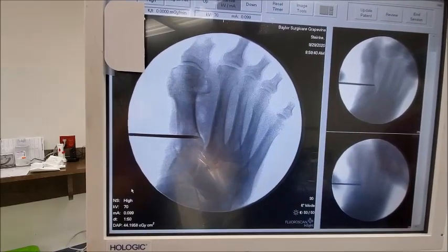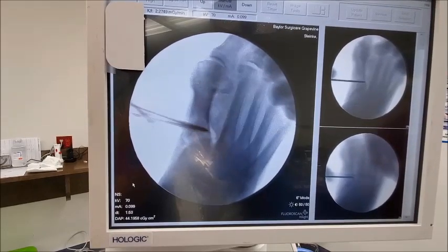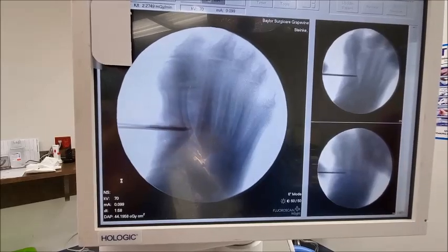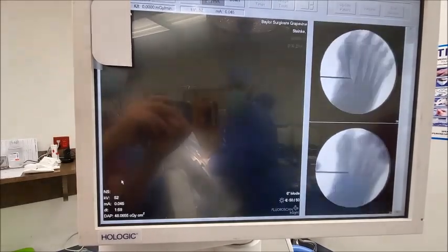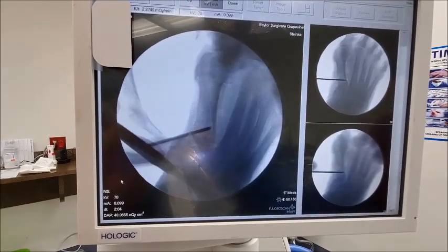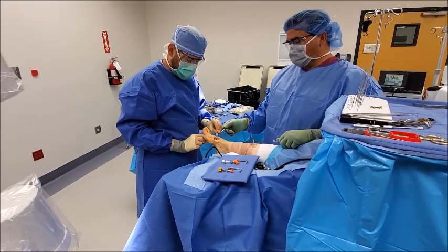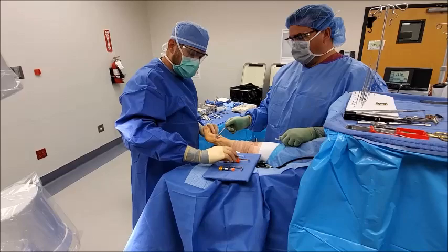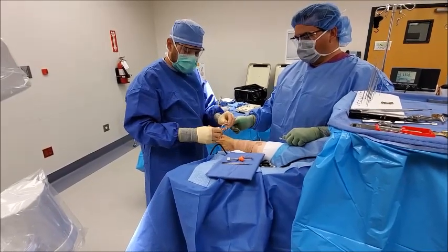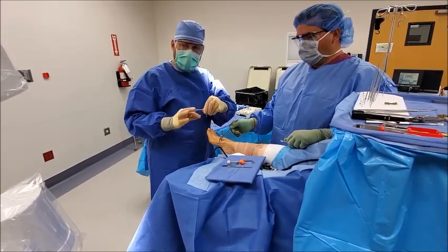On the live fluoroscan we're showing the reduction of those bones — pushing the angle together and rotating the bone ever so slightly. You can see those bones slowly tip back into position. We place this device called the speed seeker, which creates a fulcrum to help reduce that angle. Classically with this procedure a more open technique would place this reduction device directly against the bone, which results in a bigger incision.